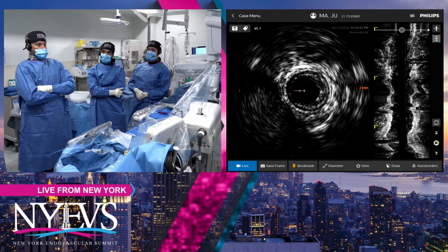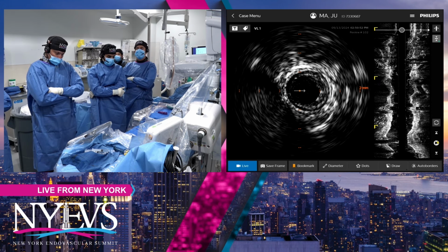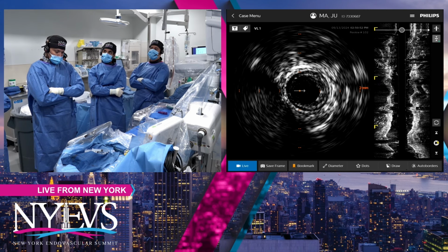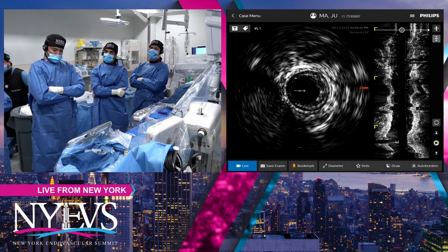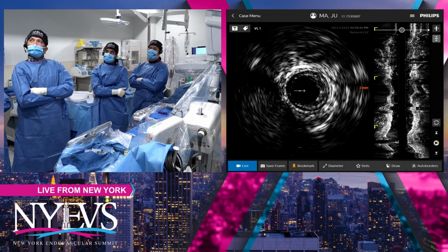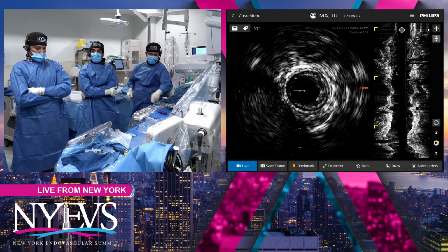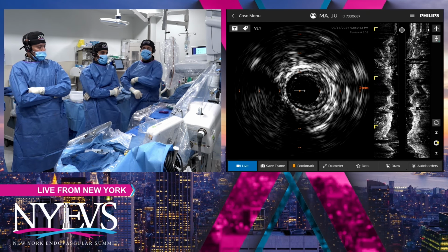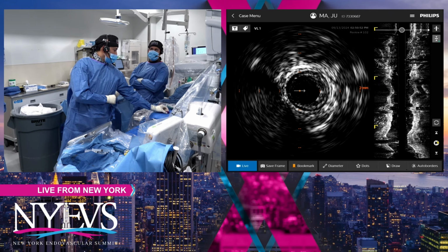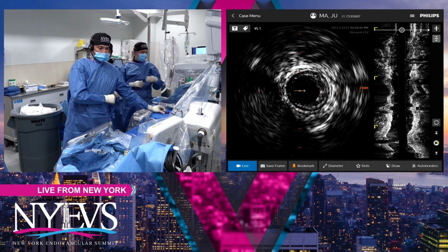For the users who've used the Rotarex with a filter over a 14 wire, of course, my understanding is off-label, have you had a problem with the wire fracture? I've had a fracture with the V18 wire on occasion, not so common in a long case. I'm just wondering what's the experience here in the US if you use a filter and a 14 wire. Yeah, I've definitely had problems with it where there's also separation of it when you use it with the different wires. So why don't you guys walk us through the IVUS, see if we can figure out a failure.